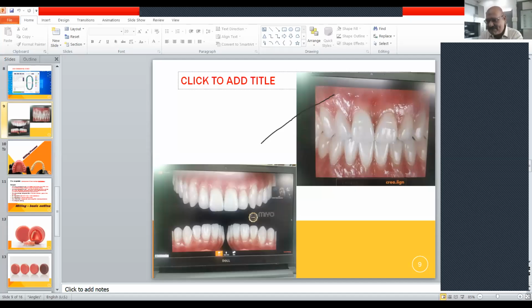That's besides the point. I am not doubting the capabilities of PEEK or the milled PEEK material. I'm just wanting to know whether it can be relined or not, because as flexible dentures, flexible material came into the market, it was being prescribed right, left, center, and then in not so experienced hands, when the patient came back to doctors, they got lost because it would require almost double the effort to do it correctly. So my question was regarding that only. What you are saying is right, that PEEK is a very good material.